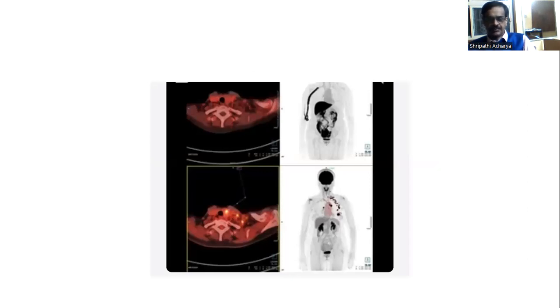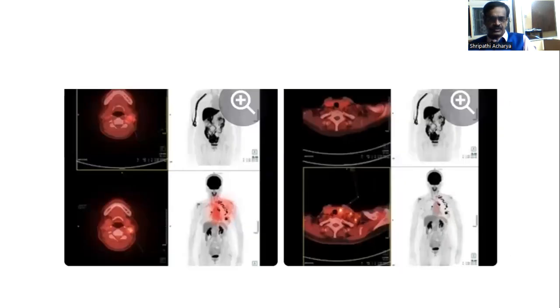The PET scan. Once again, there are the PET scan films. This computer scan will come, then it can be printed also. We can get the film hard copy, or you can make it into a CD or DVD and store the images. Whenever necessary, we can study them.